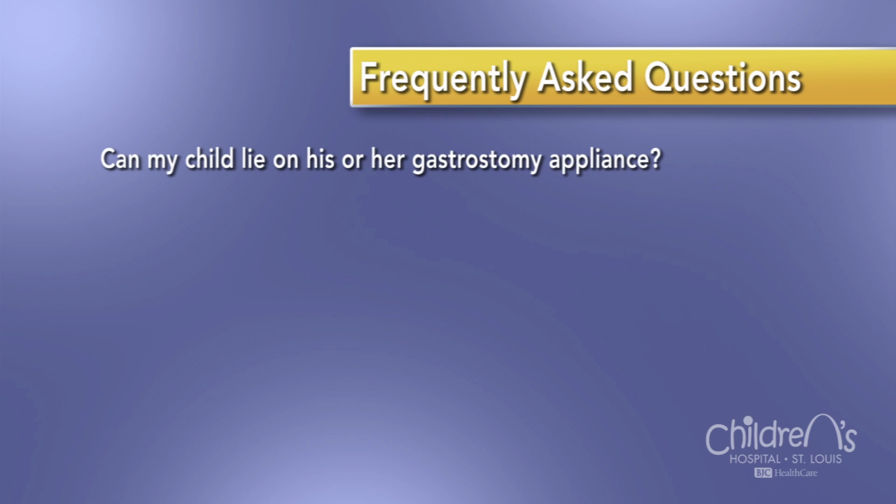Can my child lie on his or her gastrostomy appliance? Yes, once the site is no longer tender. Infants may lie on their stomachs for tummy time. Older children may sleep or lay on their stomachs as tolerated.